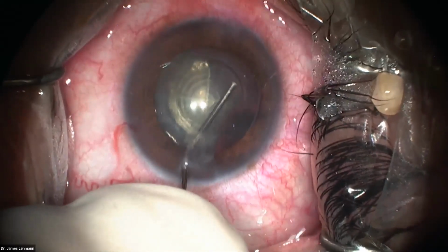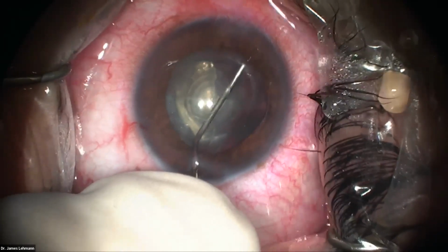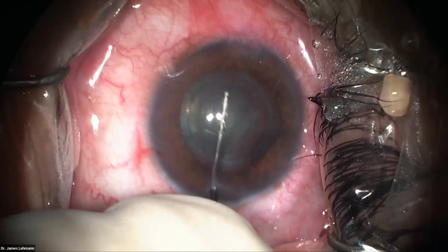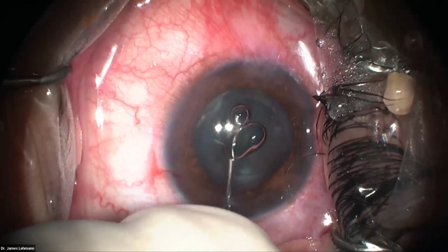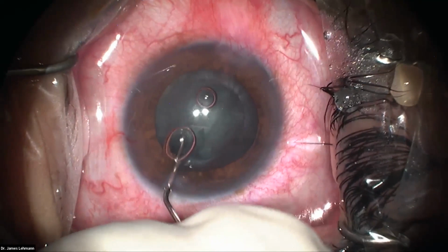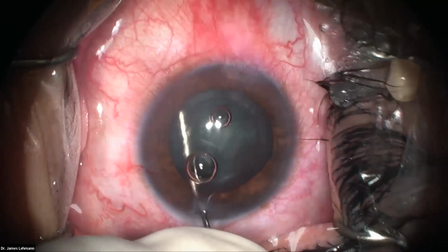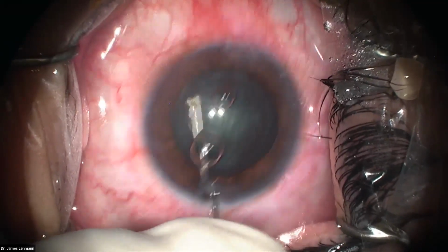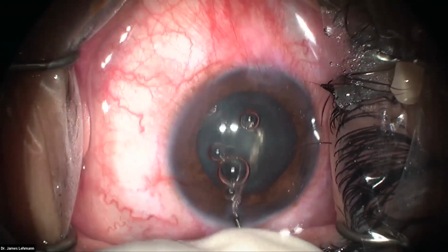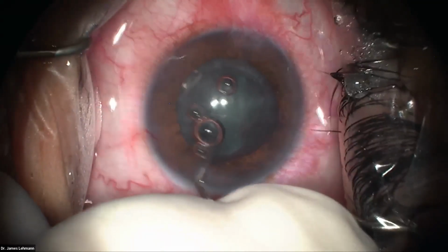And you'll see that I just have to put very little under that anterior capsular leaflet. And then I push down and the bubble's going to come. That tells me I'm pretty much freed up already. I'll rotate around for you guys. It seems, let's say maybe a little bit more. And then push down. Okay, so he has a really dense central cataract, but the cortex is pretty loose.